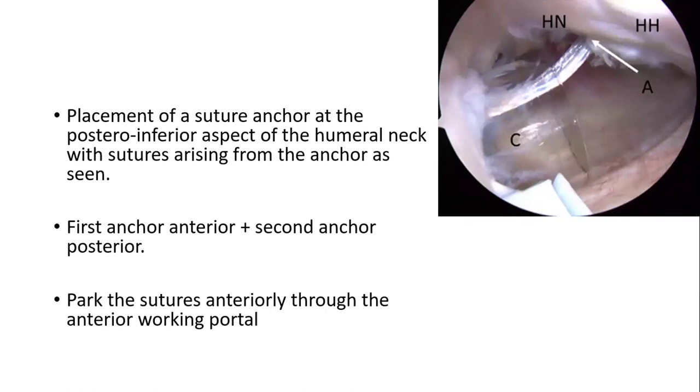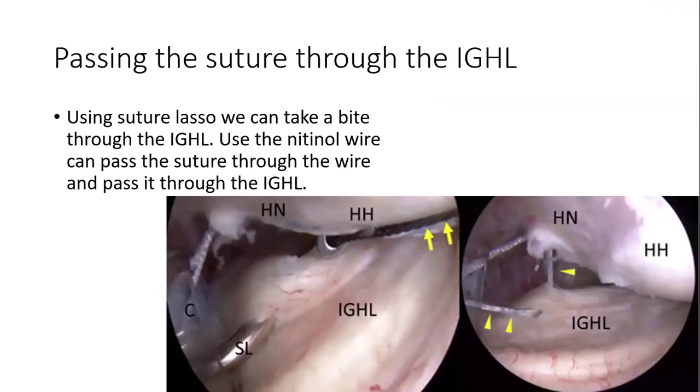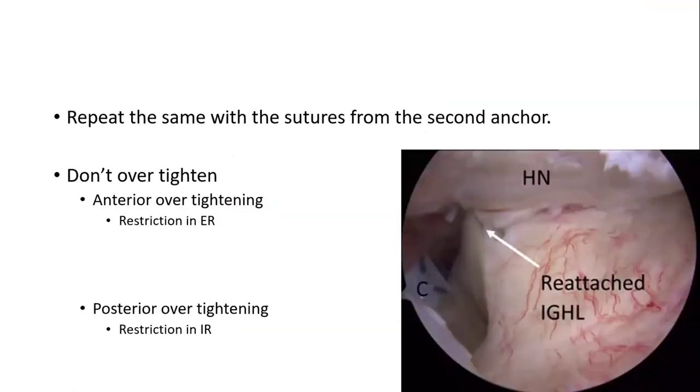And the threads that arise from the anchor, you will push and park in the anterior portal. Once you park the threads in the anterior portal, you take the suture passer and take a good bite of the IGHL, as you can see in the figure on the left side. And from the suture passer, you push in the nitinol wire, and that also goes into the anterior portal. Now, in the anterior portal, you have the nitinol wire as well as the sutures. So you tie one of the sutures, bring it out, and you'll have a configuration like you see here in the bottom right image. And you place the knot, after which you will get a reattached IGHL ligament.